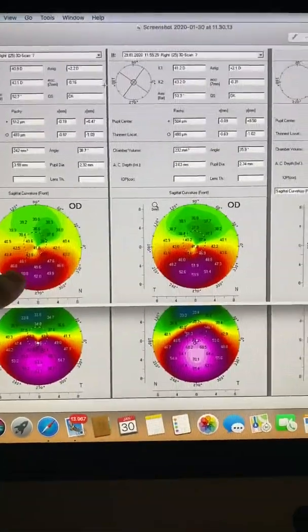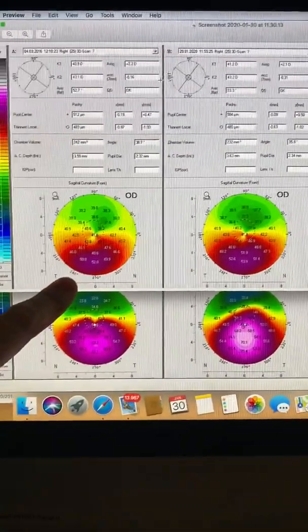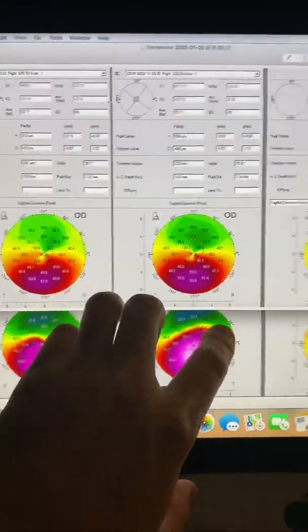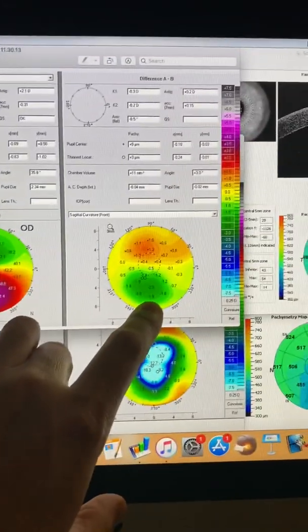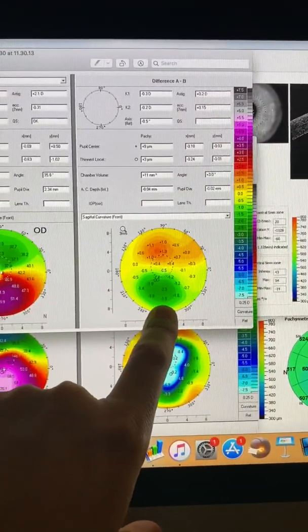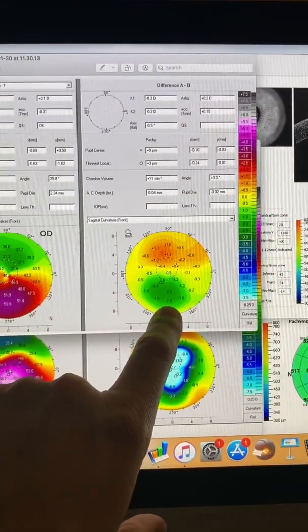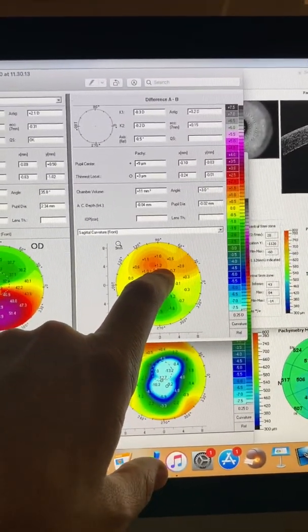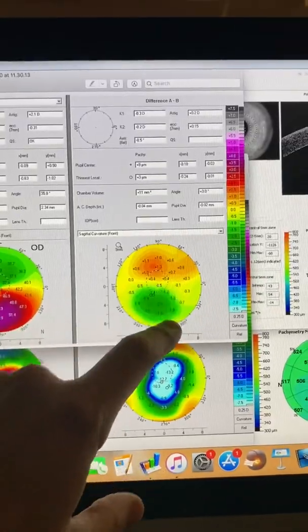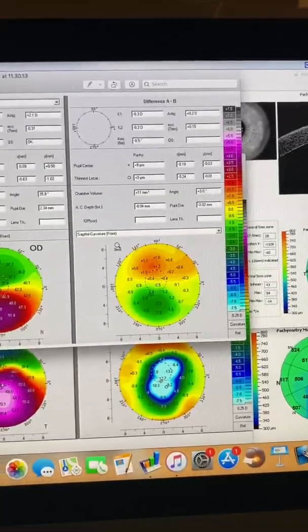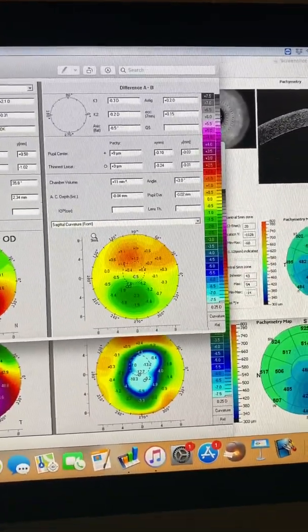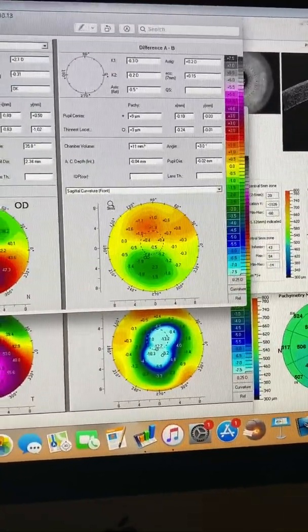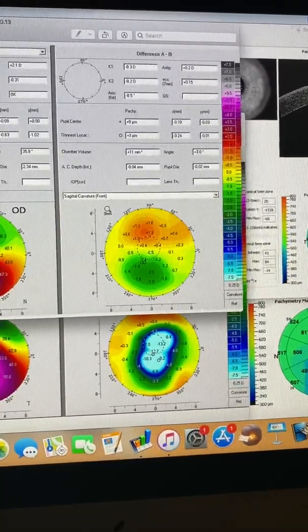And this is his cone back in 2016. This is him today. He has an almost two-diopter progression in the inferior steepening, and a 1.3-diopter flattening superior in the cornea, showing the asymmetric configuration of his cornea.